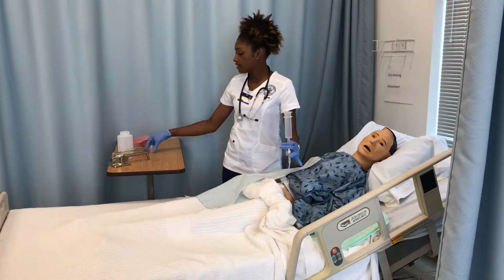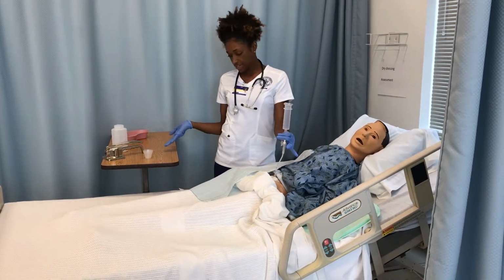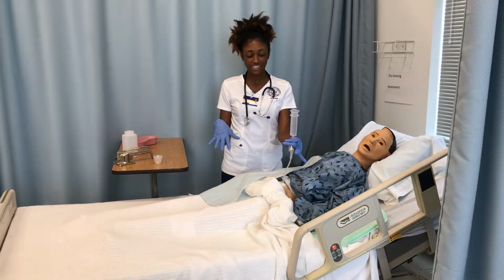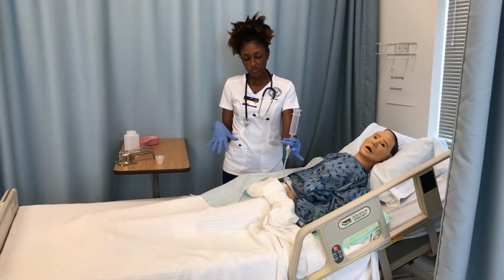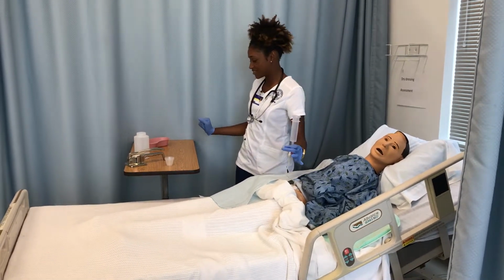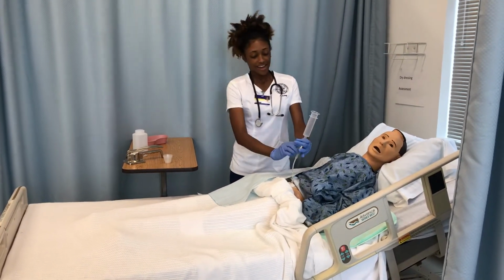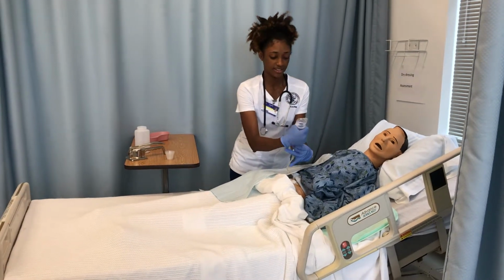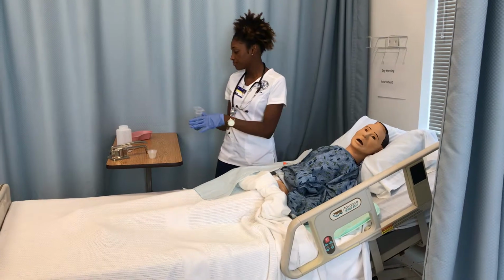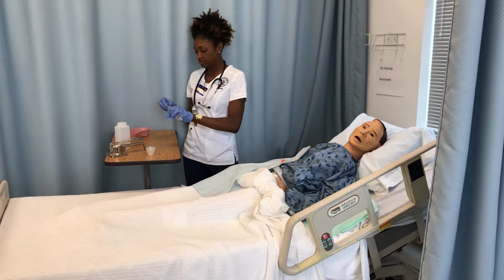If I were giving multiple medications, I would flush them with 5 milliliters of water in between each one, and then end that with 30 milliliters of water. So I'm finished administering the medication. I'll just go ahead and remove the syringe, and then I'll begin to do the feeding.